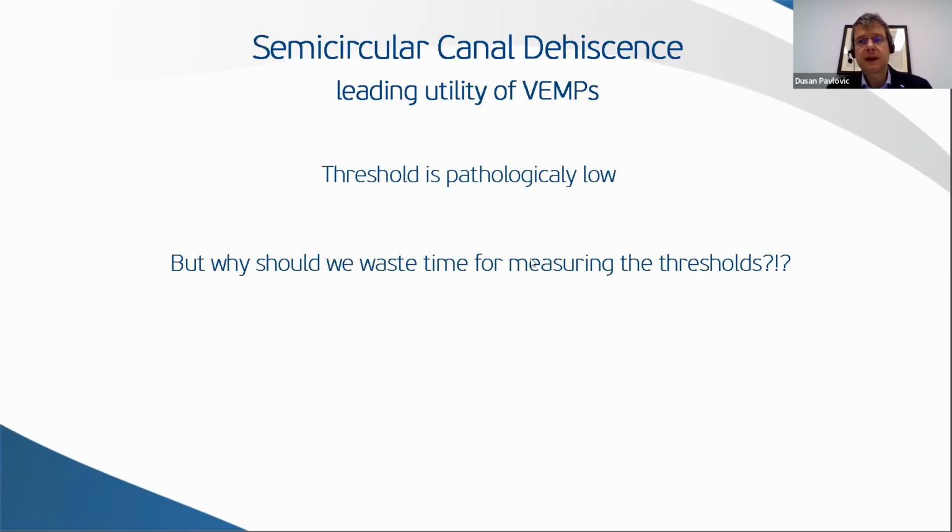I spoke a lot about this particular diagnosis, semicircular canal dehiscence, which is actually the leading utility of VEMP testing, because this is frequently an underdiagnosed pathology in clinical practice since, as I mentioned, there is a great variability of symptoms among patients.